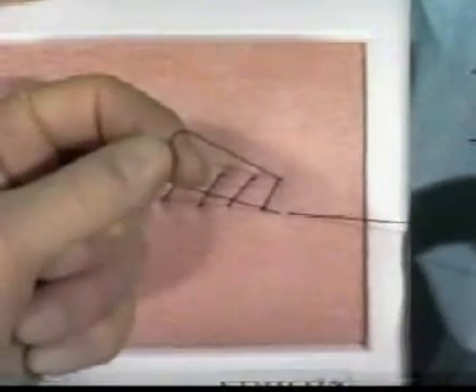If, after a continuous suture, you are left with a loop and a single strand, the Aberdeen knot may be applied.